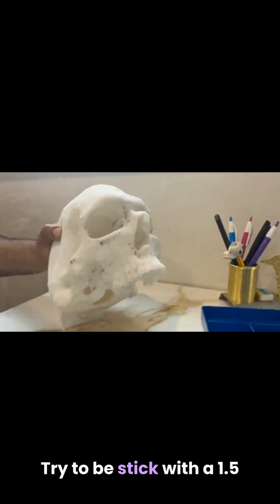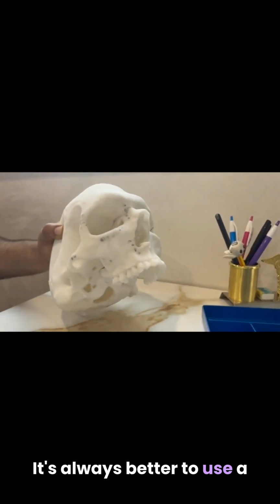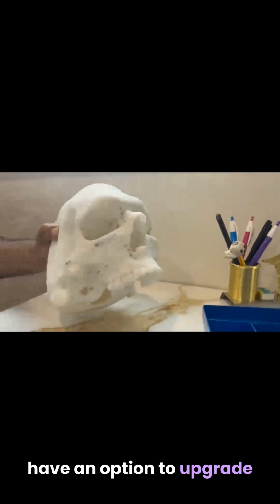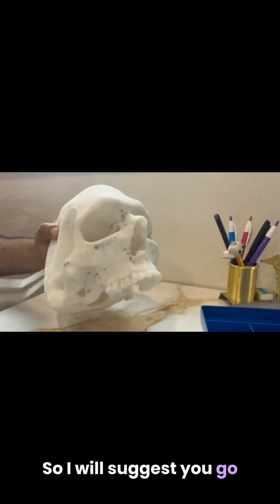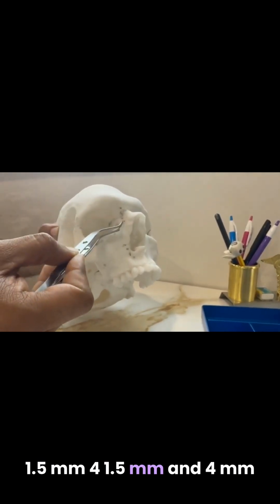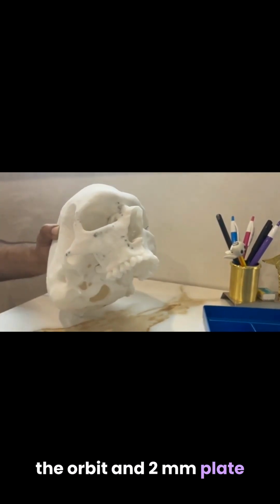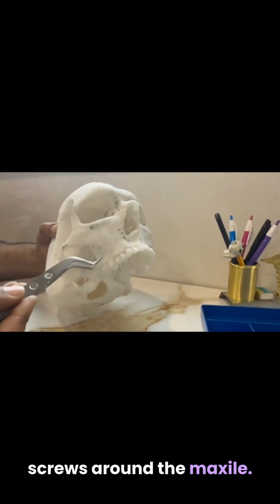Try to stick with a 1.5 mm plate or 2 mm plate. It's always better to use a lesser number, because if somehow your screw fails, you have an option to upgrade to a higher number to stabilize the fractured bone. So I suggest you go with a 1.5 mm plate and 1.5 mm by 4 mm length screws around the orbit, and a 2 mm plate with 2 mm by 6 or 8 mm screws around the maxillae.